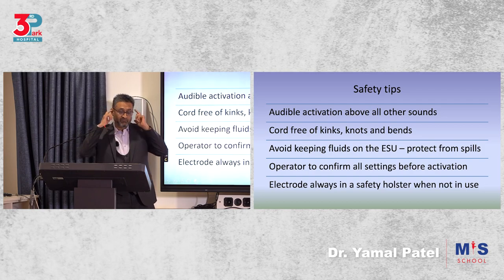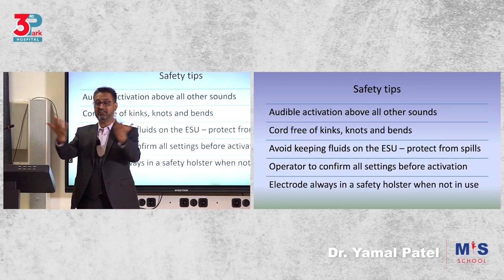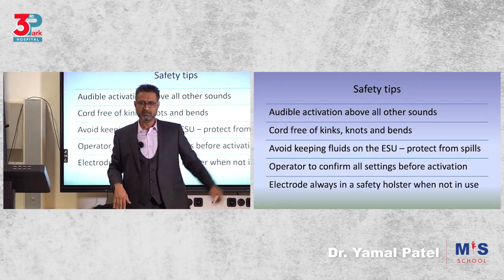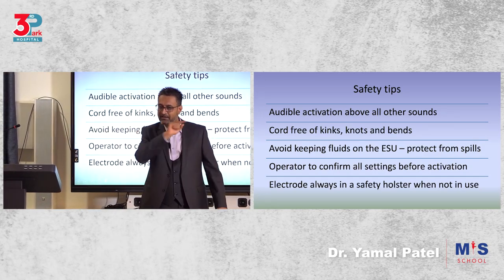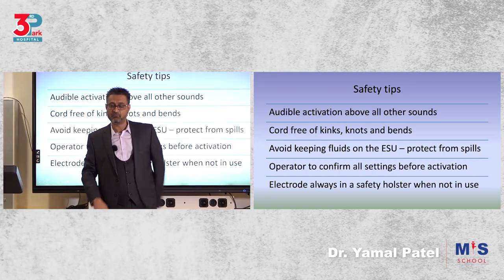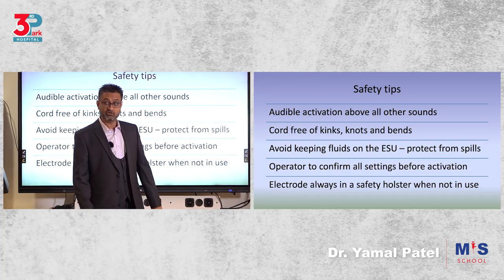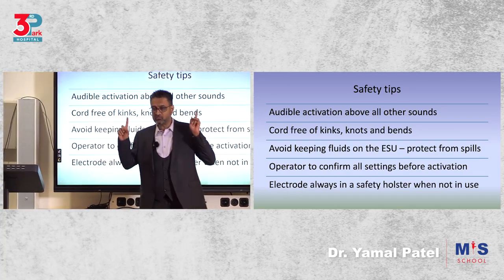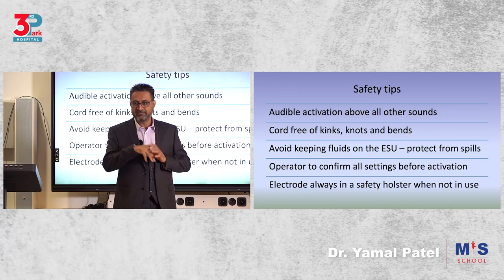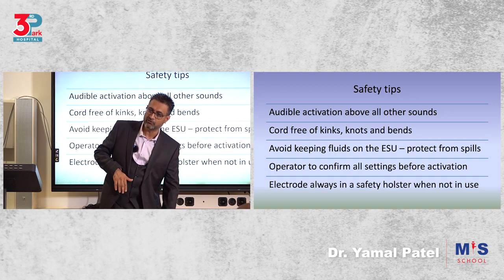Keep the volume of this equipment loud, so it should be audible above everything else in the theater. Why? Don't say that's noisy, reduce the volume. And you have your music. Fine, have your music, but the volume should still be loud so that when this instrument is lying on a patient somewhere or it's in there and the nurse or your assistant is just by mistake pressing it, you'll hear the ting, and you'll be like, who pressed what? Immediately. And then you look for where that electrode was. Because if you don't, it will burn something. If it was lying on the patient, it will burn without you knowing.